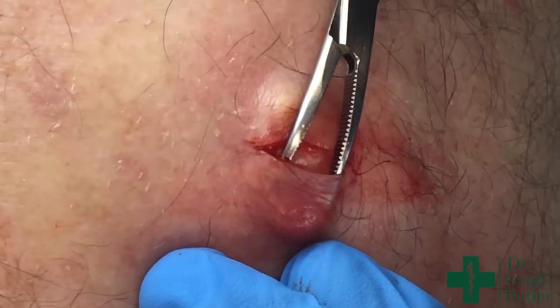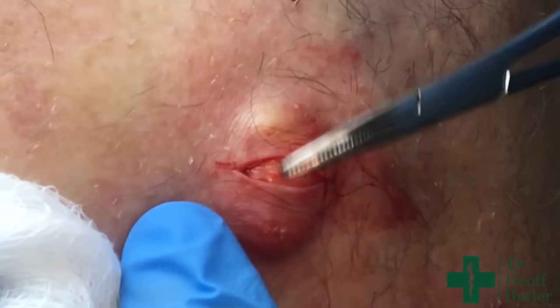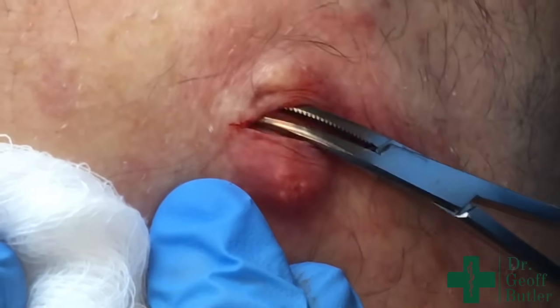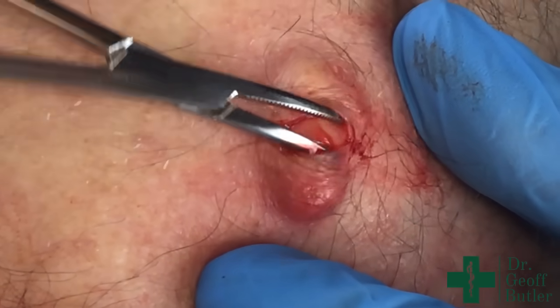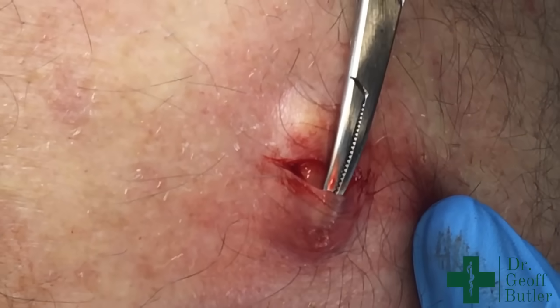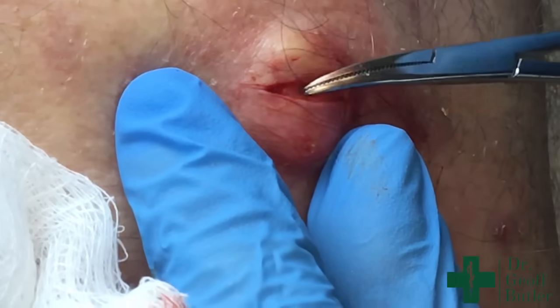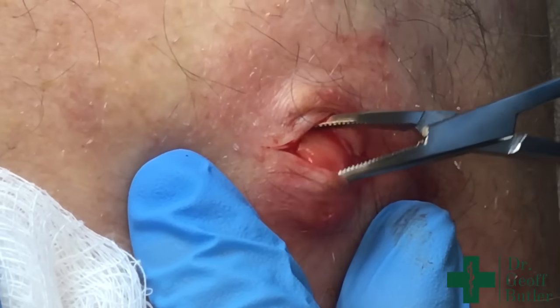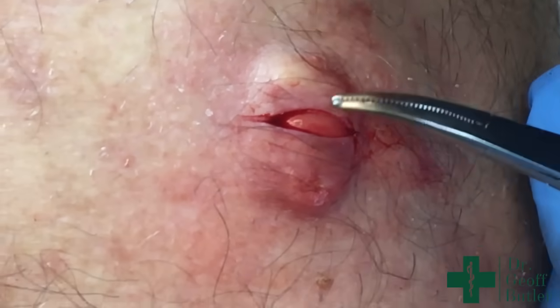If anybody's seen enough of these videos, you should be able to tell that this is cyst membrane underneath — that's what we're looking for. What I'm doing is using the curved crylies to gently break down some surface adhesions. You can do this with scissors as well — that's more of a sharp dissection. The only risk, obviously, is that you can rupture the membrane. You can see that just by doing that, it's popped up a little bit. Now I'm going to extend that just a little bit more.